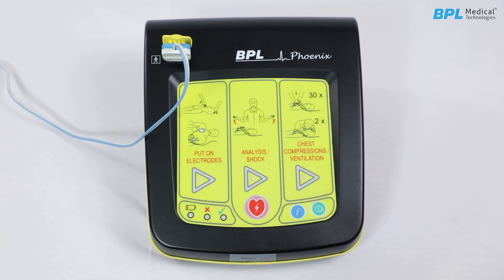Using the DF2628 during an emergency. Stage 1: put on electrodes. When the device is switched on, the user is prompted to stick the electrode to the patient's chest. The workflow triangle 1 and the LED light up. Voice prompt delivery is simultaneously activated.